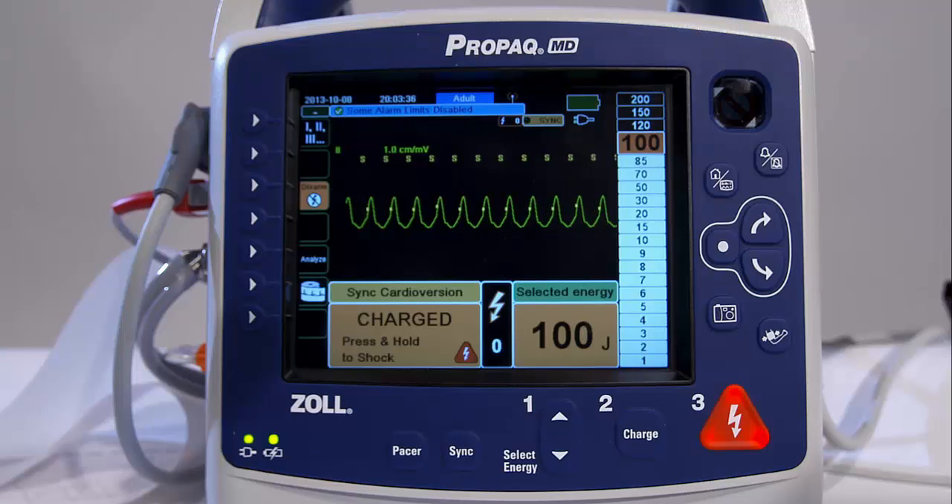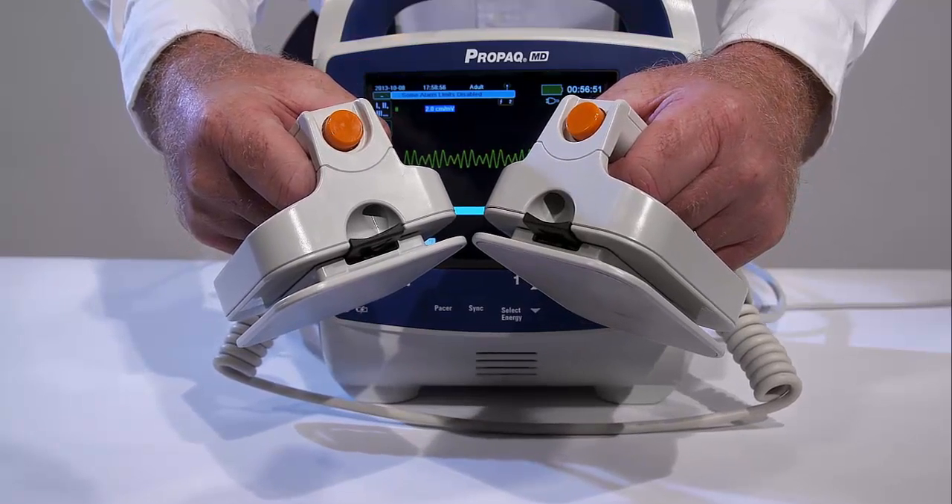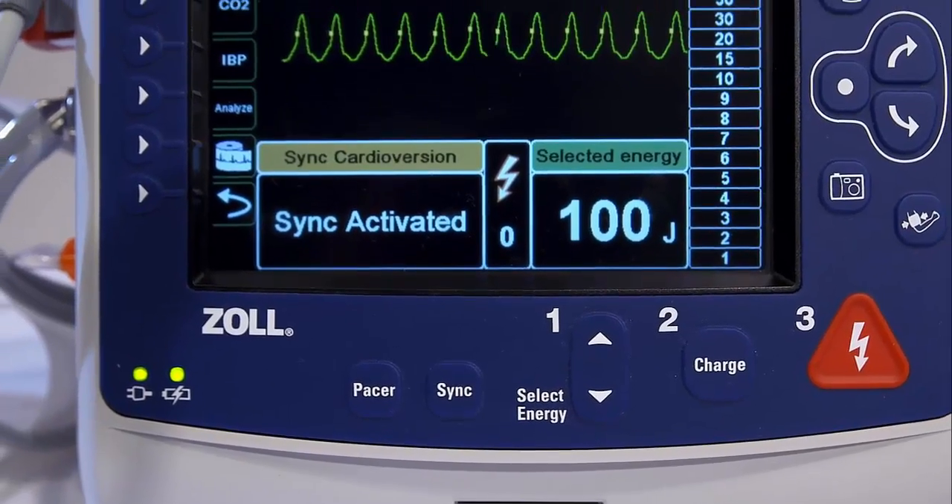When using paddles, the Charge button is found on the Apex paddle. When you hear the same tone, the energy bar graph will also show when the selected energy level is reached.